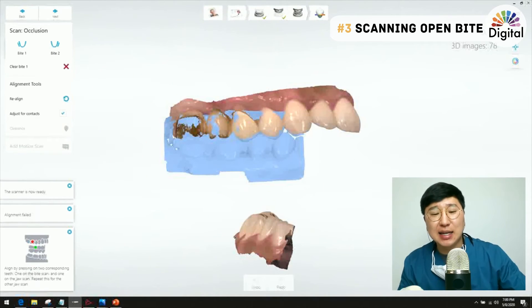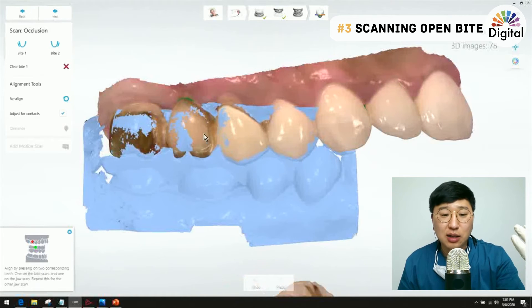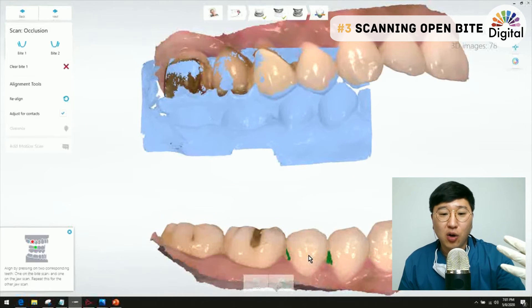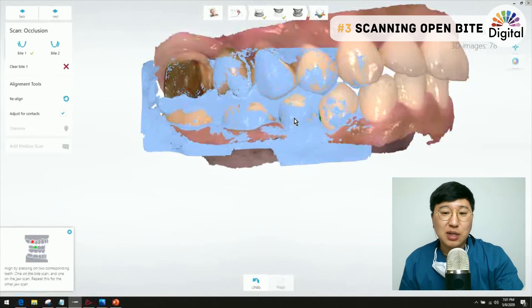I keep scanning the posterior and occlusal side until the canine. The upper got alignment automatically but it doesn't look so great, and the lower didn't get automatic alignment either. Of course I could do manual alignment with the red and green dots, but let me try a different approach.